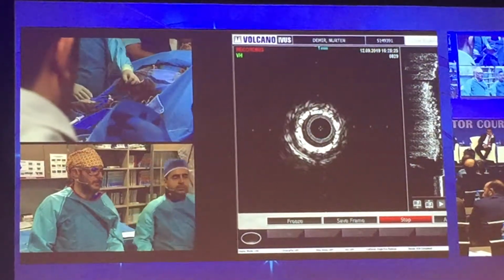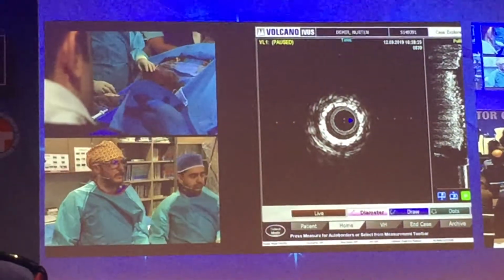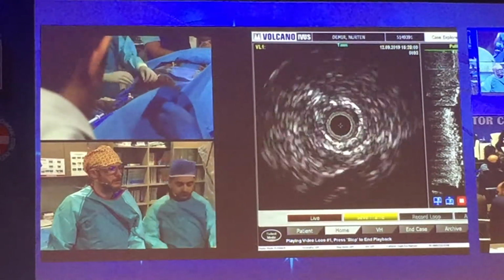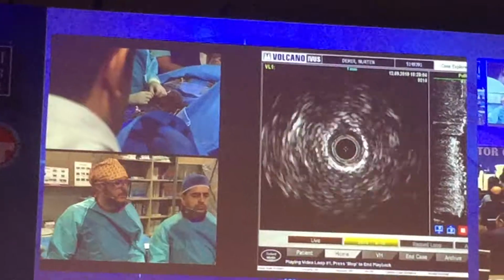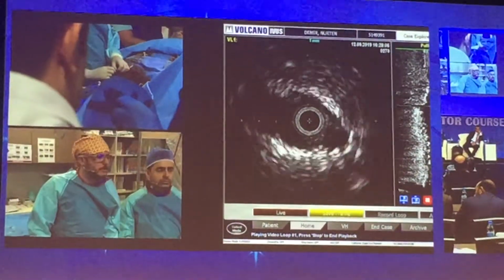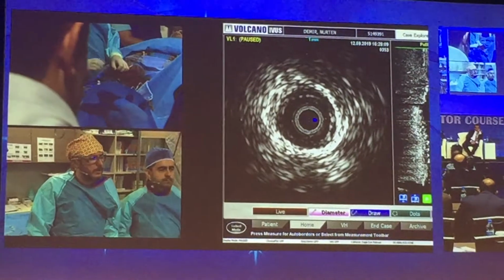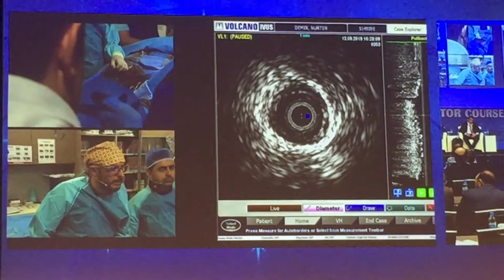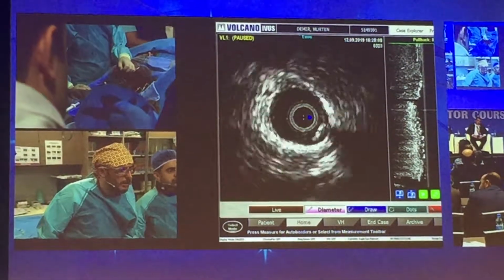Yes, okay. So what do you think about that? I think I have seen a 3.0 in the stent segment and 3.5 in the proximal segment of LAD. Yes, good. And can you show us the measurements of IVUS in the still images? It will be a very good demonstration for us, especially in the stented segment and the distal and proximal segments of the stent.